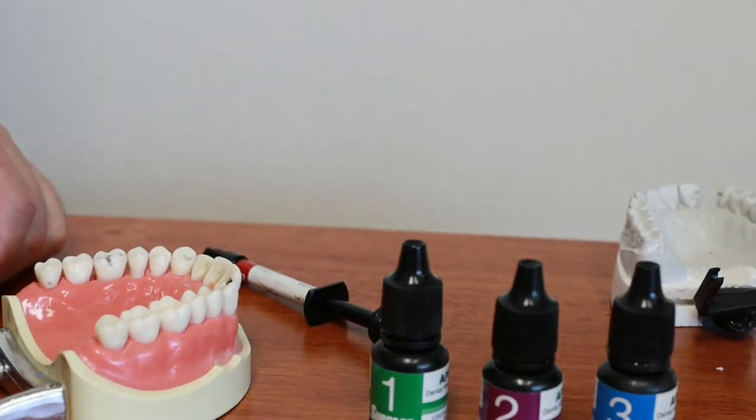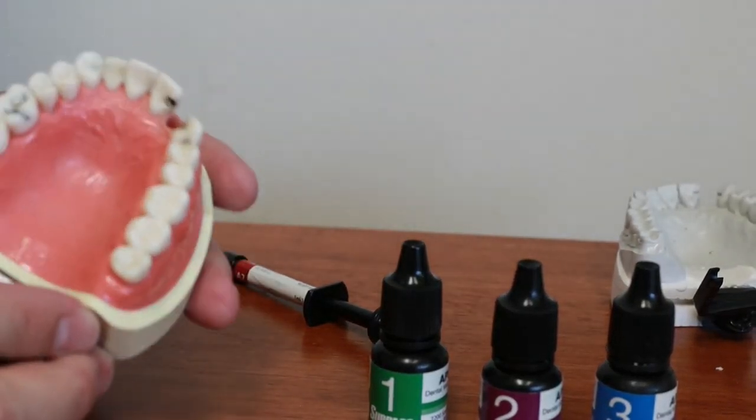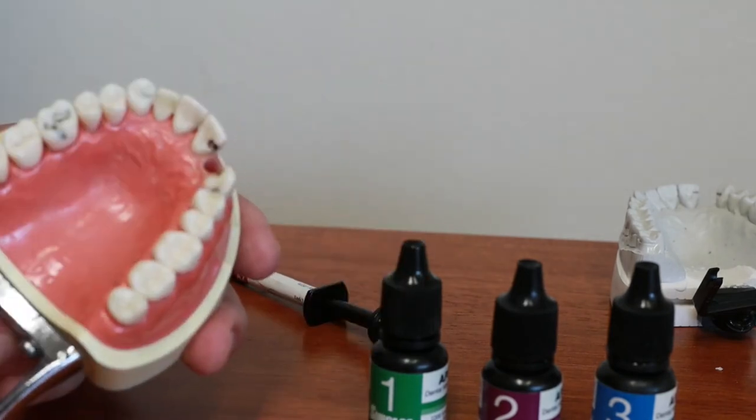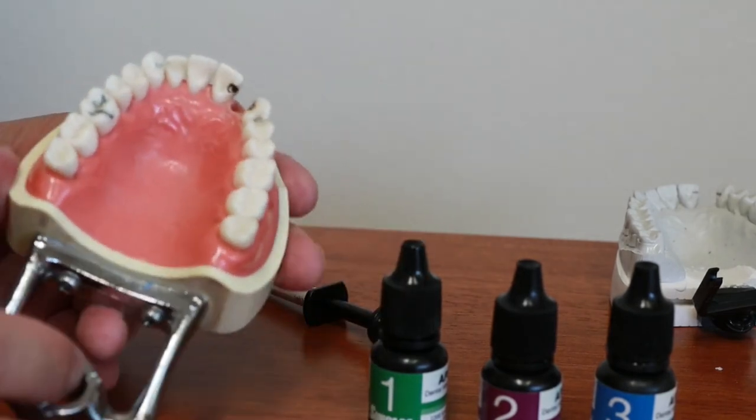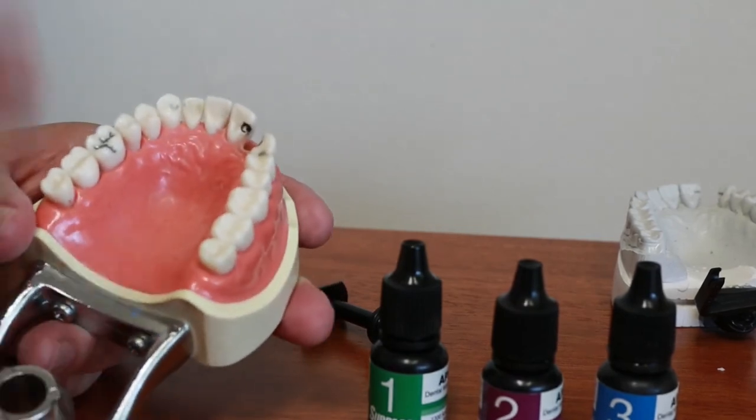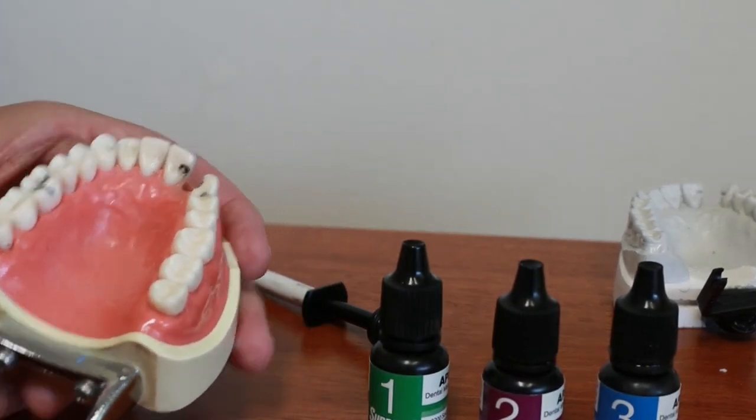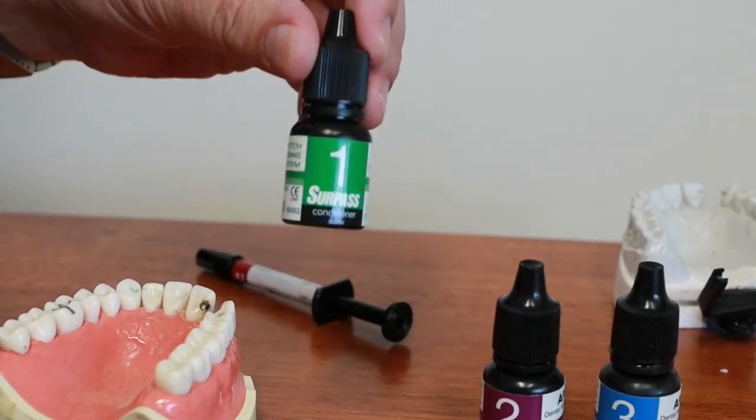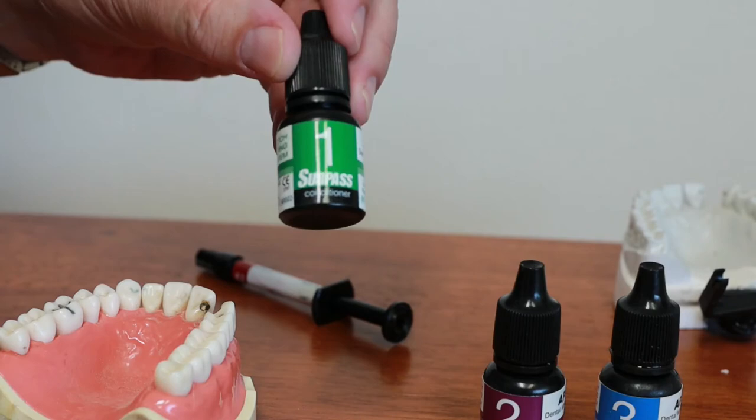Now we're ready to bond the bridge in. On a patient I would isolate it, put some cotton around it, maybe even put a rubber dam around these teeth or isolate, make sure it's nice and dry. And then I apply my bonding agent. I use a bonding agent called Surpass made by Vista Apex. It's a three bottle system.